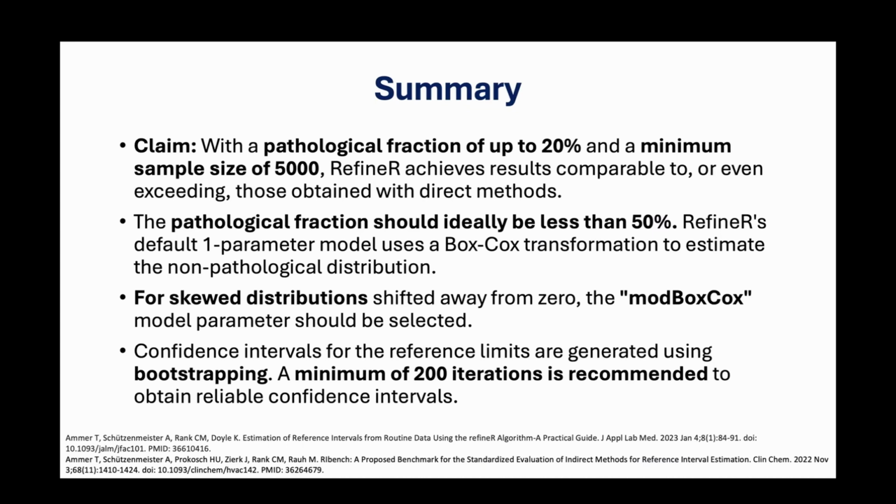And also we can calculate confidence intervals of reference interval limits. To estimate these confidence intervals, we have to conduct bootstrapping. And for this bootstrapping protocol, a minimum of 200 iterations is recommended to be entered in the R code.